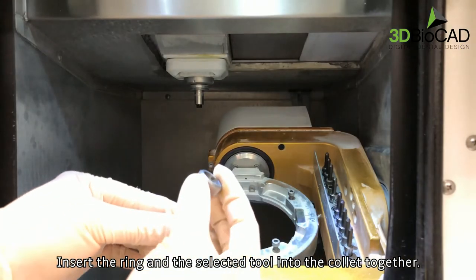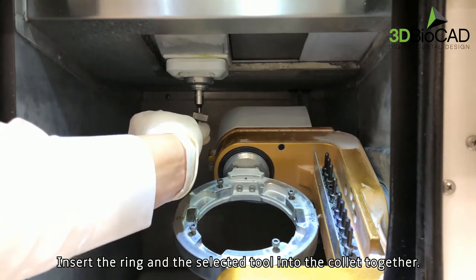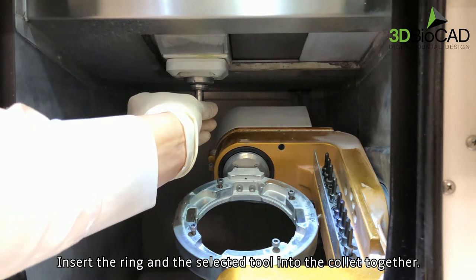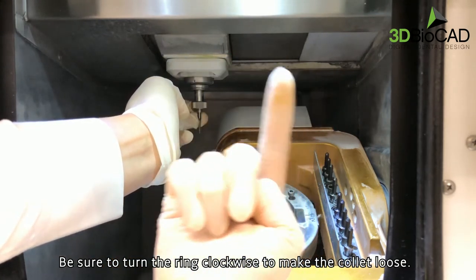Insert the ring and the selected tool into the collet together. Be sure to turn the ring clockwise to make the collet loose.